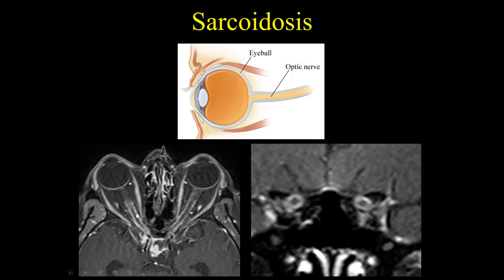This case has a similar finding — diffuse enhancement involving the dura, the sugar-coating enhancement — but notice that the caliber of the optic nerve has been preserved. When you see something like this, this is more leptomeningeal spread. In this particular case it was sarcoidosis, but we can see it in other etiologies including lymphoma, leptomeningeal metastasis, and also tuberculosis. If you come from a part of the world endemic with tuberculosis, realize that tuberculous meningitis can give a similar appearance.